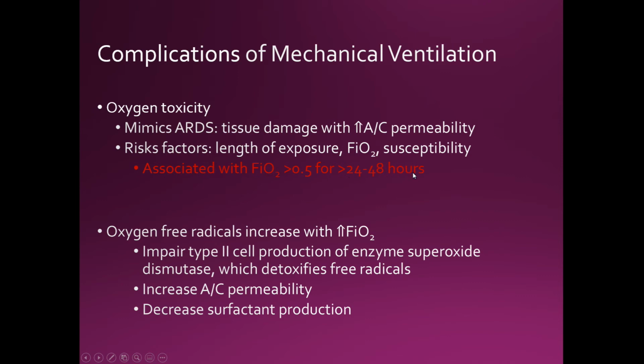Now I'm going to tell you this in subacute, and I told some other students this, at night shift. If you have someone with thick tenacious secretions, they're triggering the vent, and you want to have a quiet night for yourself and for the nursing staff, what RTs would do is crank up the oxygen.